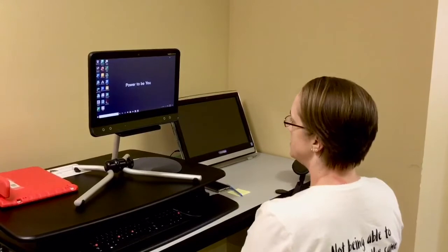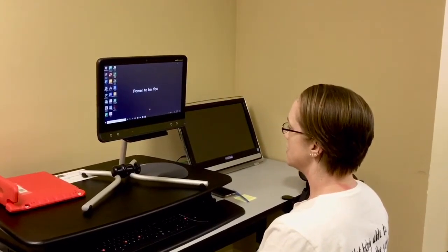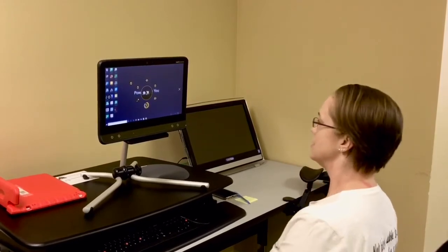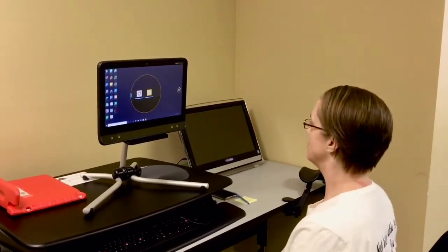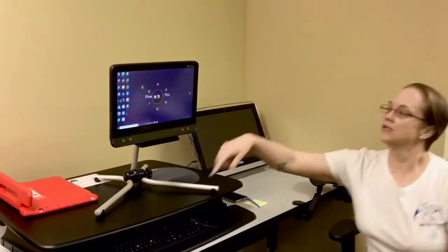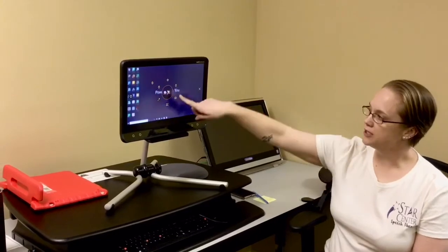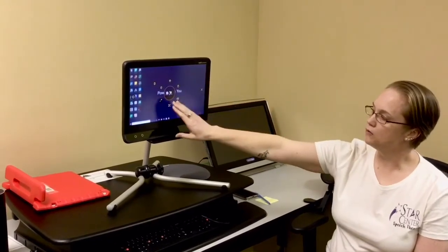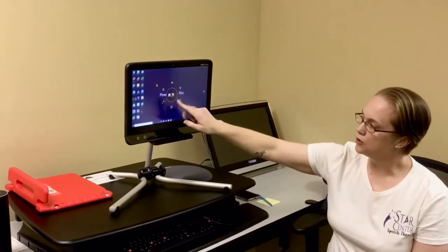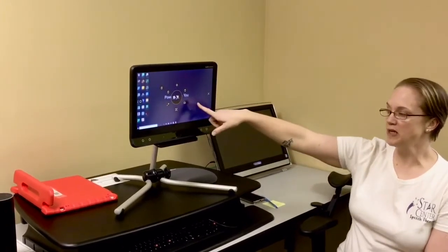Once you get into your communication apps, it is a little different. So, hang on. So this is the control I opened up. There's double click, single click, right click. This one will move whatever I'm looking at a little closer so I can get more specific. You can click and drag. You can pull up a keyboard.